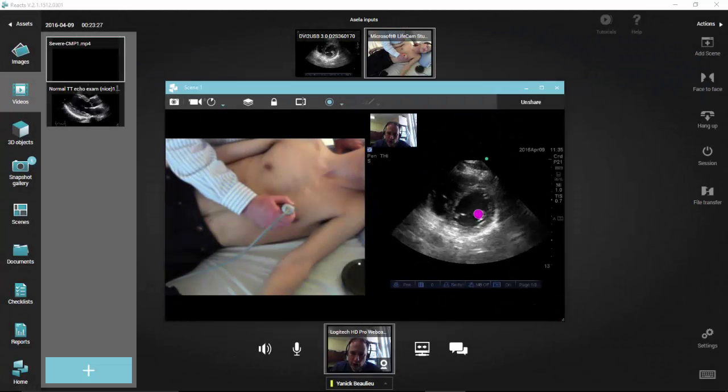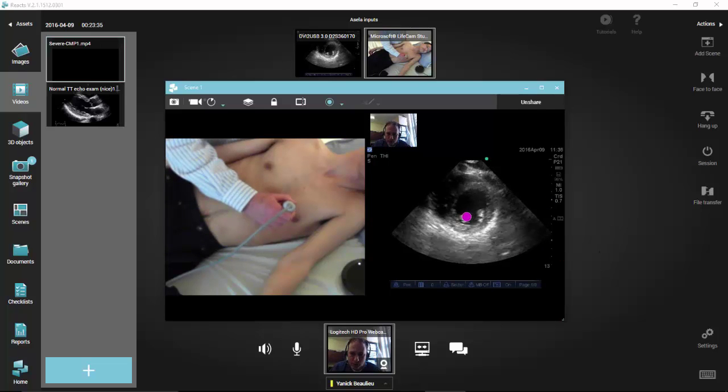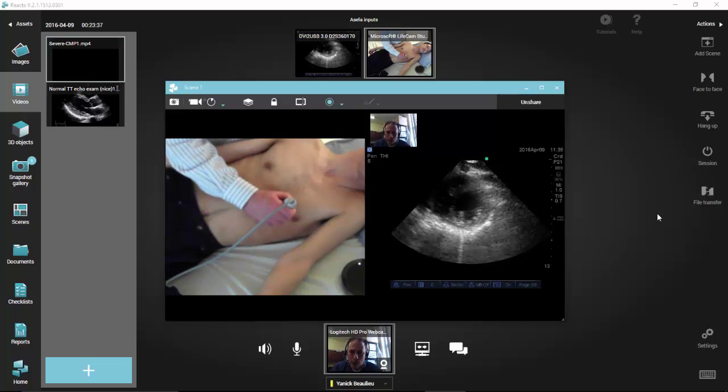And we can see the papillary muscles now. Well, I see the anterolateral one better than the posteromedial, right? Totally. And as you're aiming down toward the apex, you will probably see your, yeah, here you go. Your posteromedial, that's super nice now. You can see your pericardium nice and bright, as you can see at the bottom of the screen.